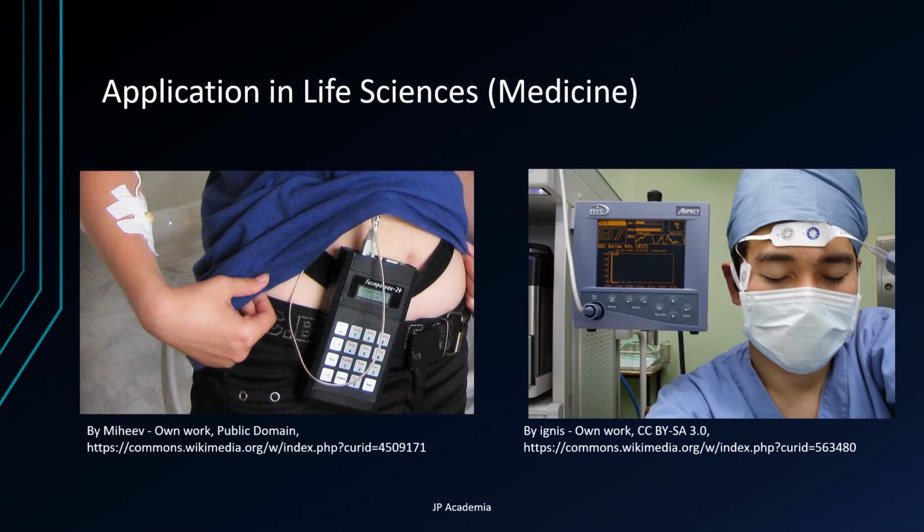Many of our modern diagnostic equipment utilize electrical technology. First picture here is a device used in gastroenterology. And this is a 24-hour esophageal pH metry. This is a test to confirm the presence of reflux and mainly to assess the severity of the reflux. The test results can be used to effectively decide with regards to the medical treatment and what endoscopic or surgical methods are needed.